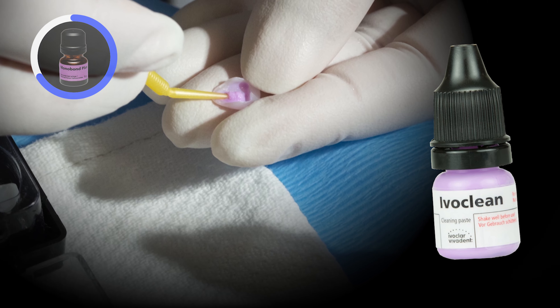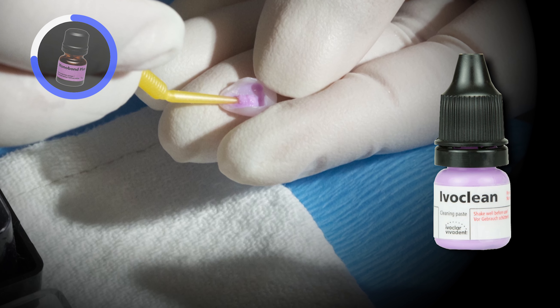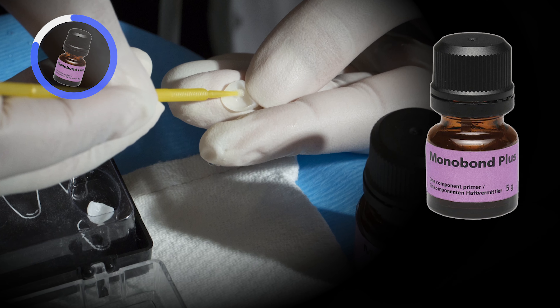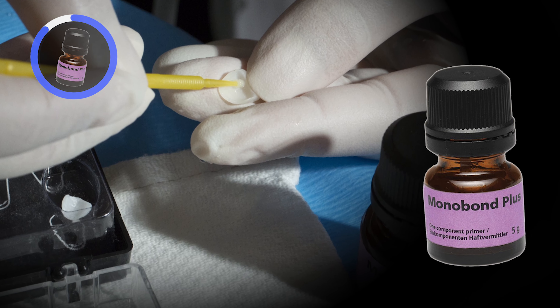After gluma, I then scrub a layer of 3M Scotchbond Universal for at least 20 seconds per tooth to ensure the resin monomers effectively infiltrate any exposed dentinal tubules and into the enamel matrix.